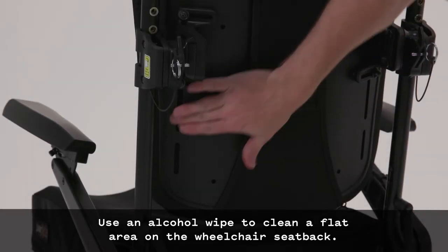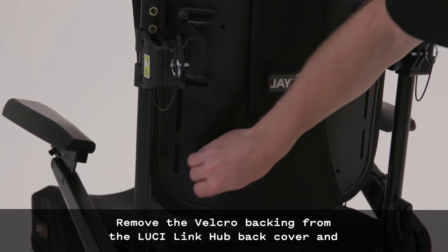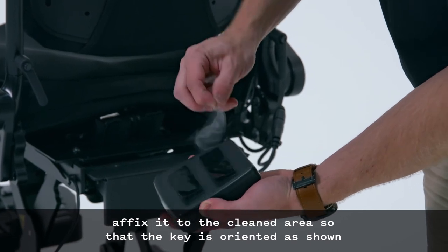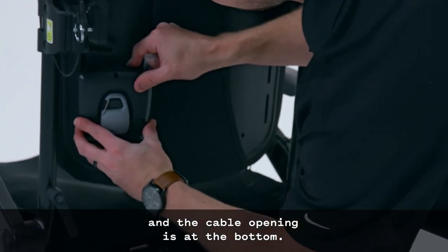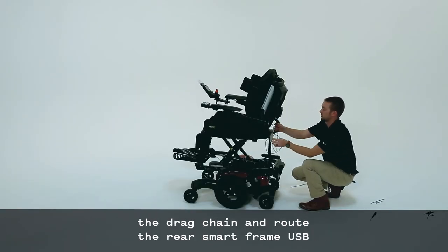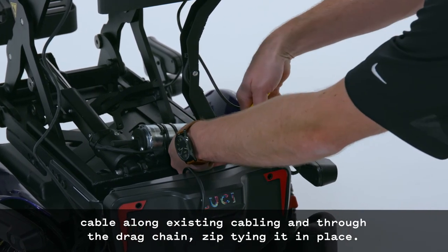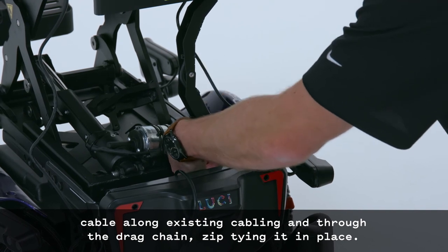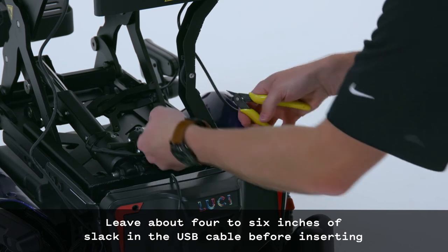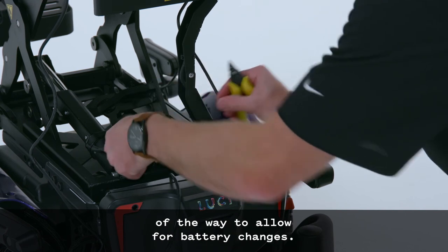Use an alcohol wipe to clean a flat area on the wheelchair seat back. Remove the Velcro backing from the LucyLink hub back cover and affix it to the cleaned area so that the key is oriented as shown and the cable opening is at the bottom. If the wheelchair has a seat elevator, clip the existing zip ties along the drag chain and route the rear smart frame USB cable along existing cabling and through the drag chain, zip tying it in place. Leave about 4 to 6 inches of slack in the USB cable before inserting it into the drag chain so the smart frame can be rotated out of the way to allow for battery changes.